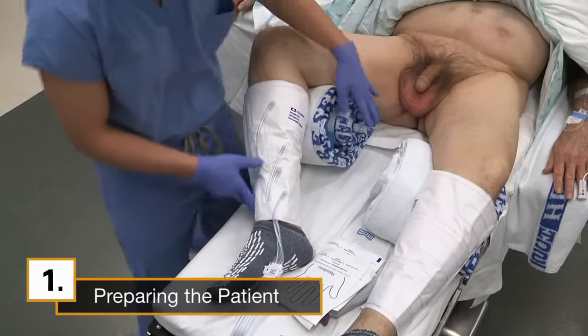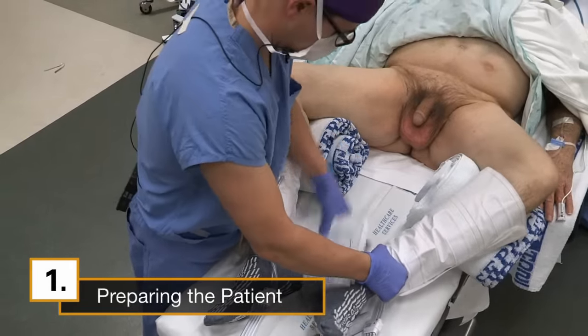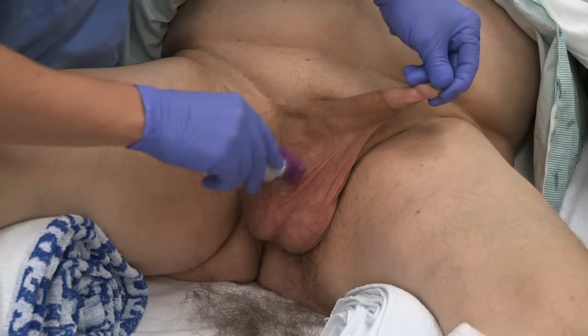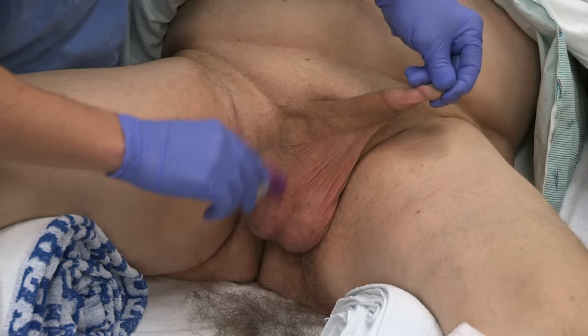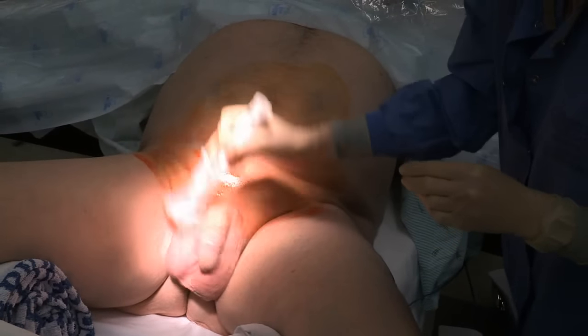My team positions the patient in supine frog leg by placing anatomic rolls beneath the knees to provide lateral leg support. We use a shaver for the scrotum and remove all of the hair fragments. A preoperative scrub is used and I choose chloroprep.